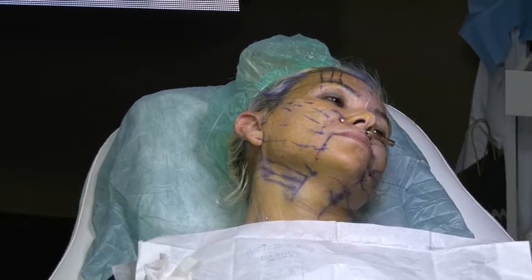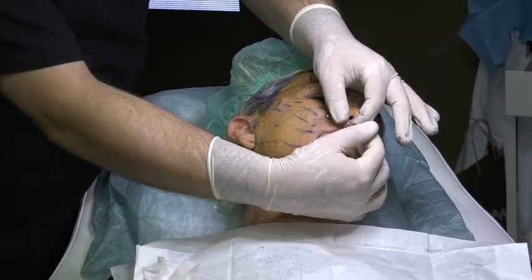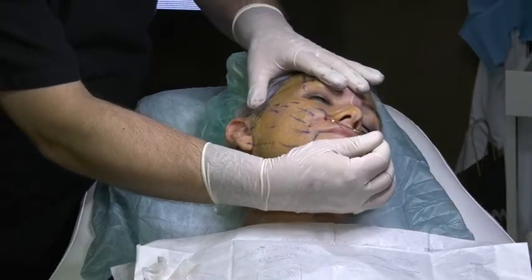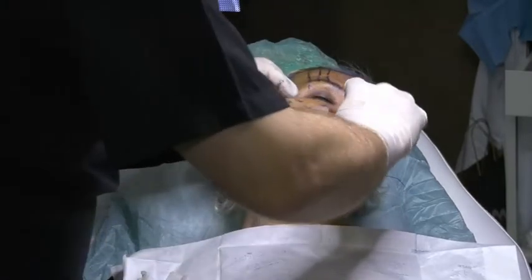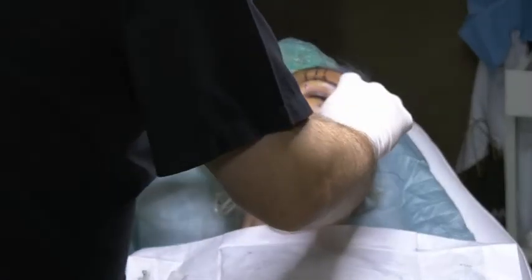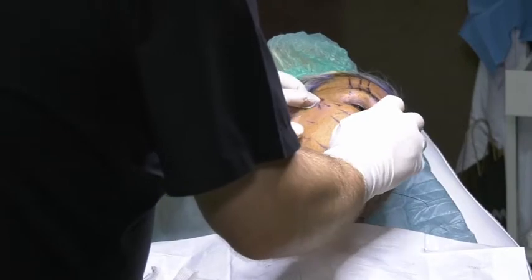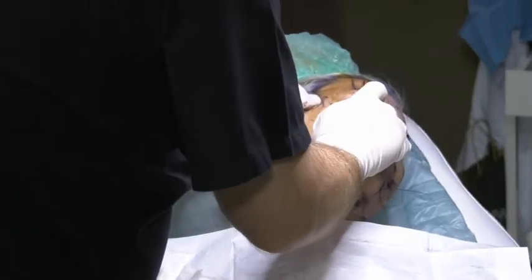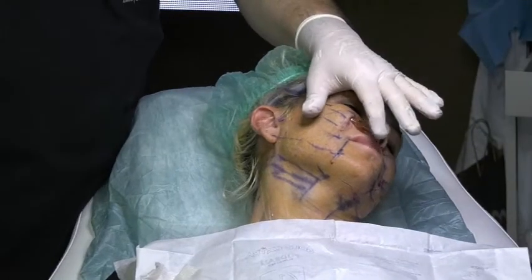You can go back, but you have to hold the thread like that. Look, like that. Together, we can go back. No problem. Now it's okay. Then I drive again. Slowly, press up. Slowly, press up. Okay? Till the end. What do I have to do now?